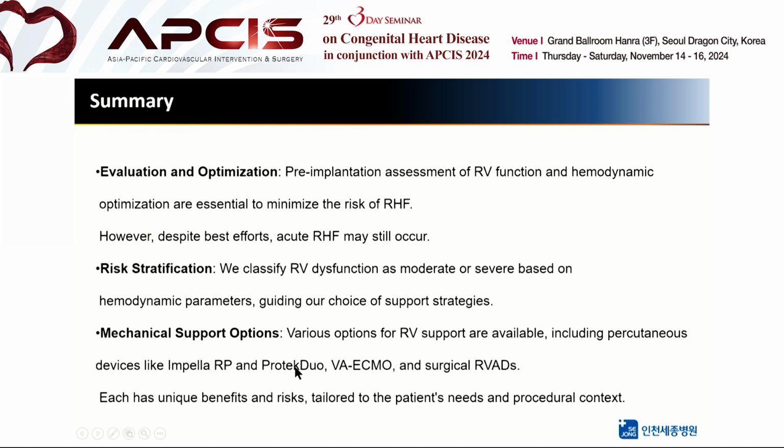But in Korea, unfortunately, ProteK and Impella are not available, but someday they should be imported. And each has unique benefits and risks, tailored to the patient's needs and procedural context.